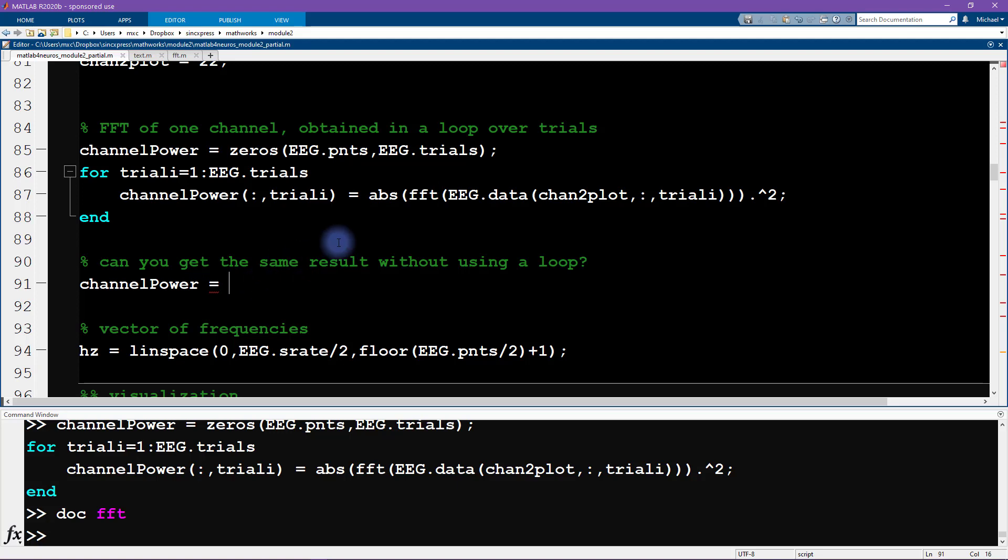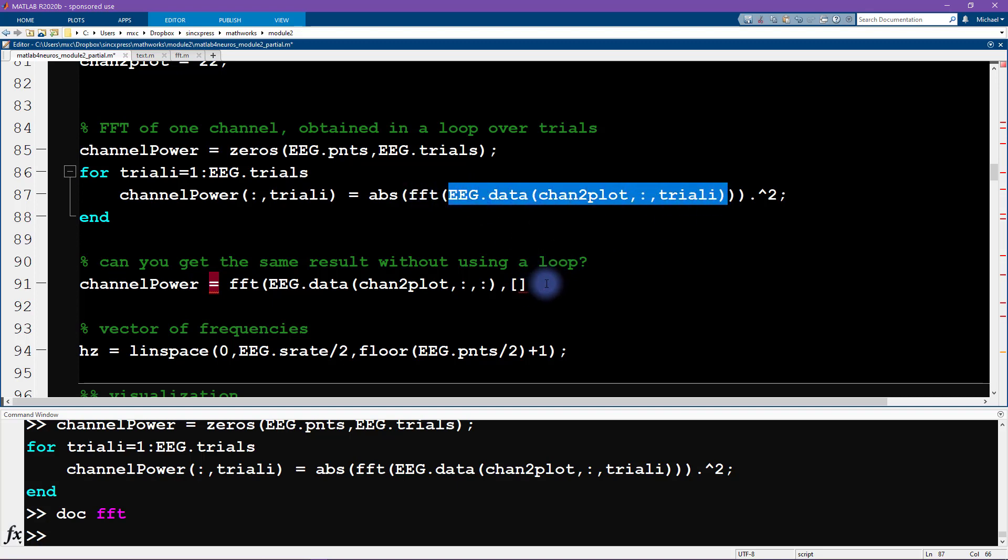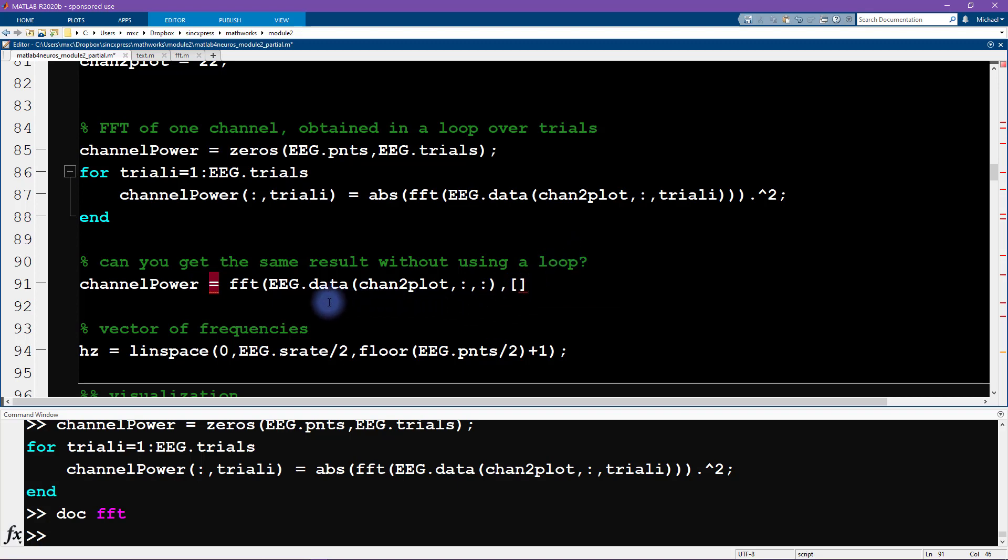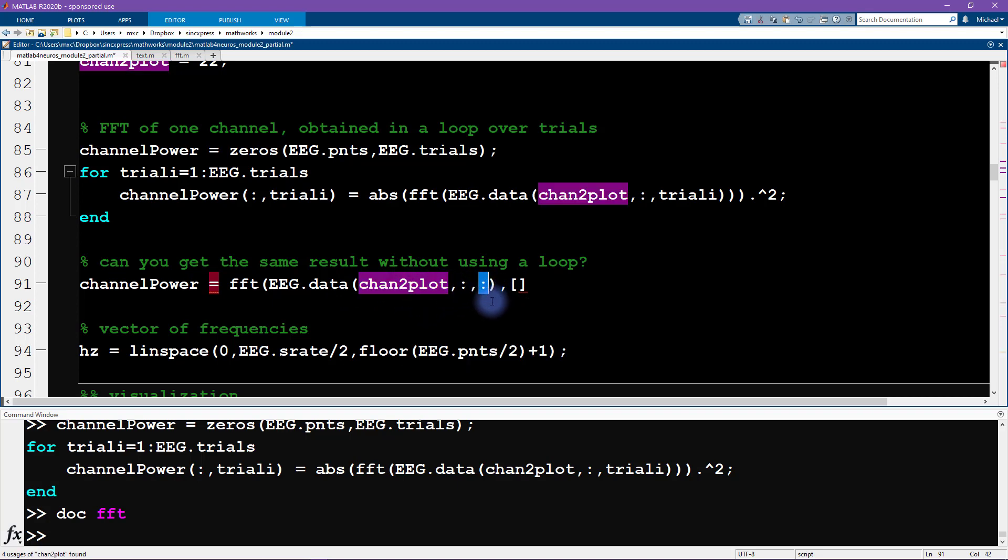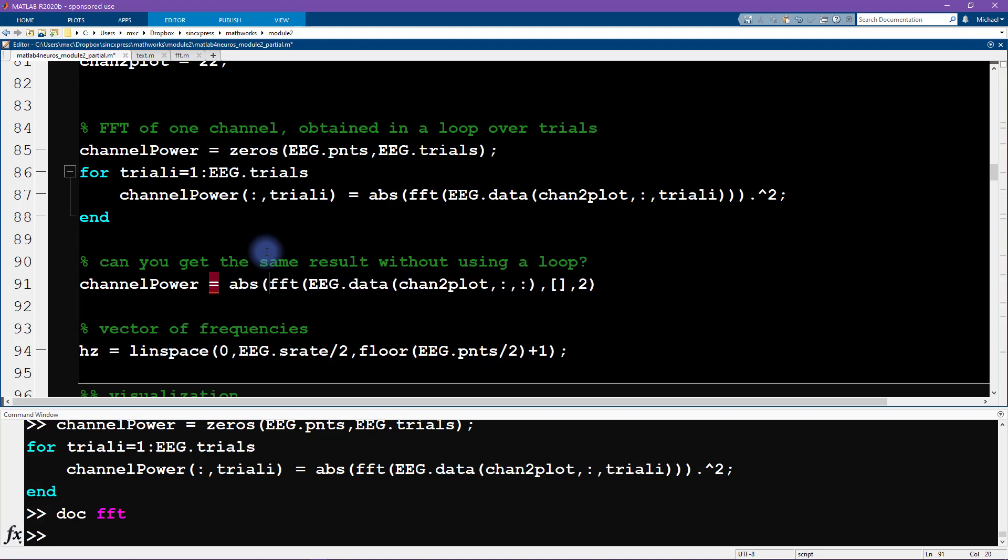We can write FFT. Then we want the data from the EEG data from this channel, chan to plot. We want all of the time points and all of the trials. The second input is related to the end of the FFT, so we're going to input an empty bracket, which tells MATLAB to use its default value. Now we need to specify which dimension. We want the Fourier transform over time, so the third input is going to be two corresponding to the second dimension, which is the time points. Then I'm also going to take the magnitude and we take the magnitude squared.